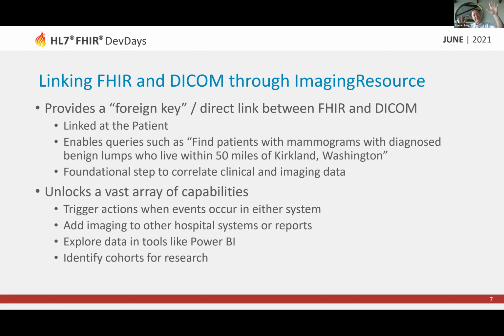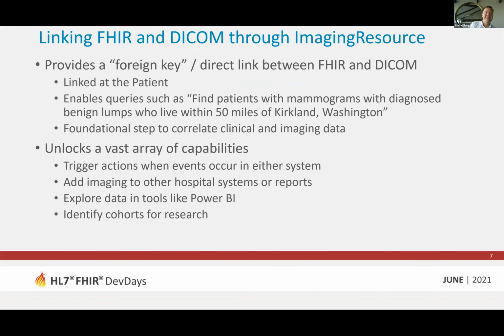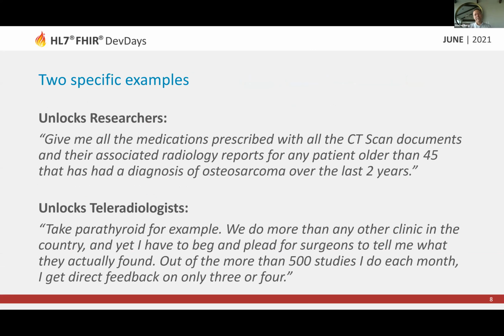But we have all the diagnoses for pneumonia here, but we don't know if there are chest x-rays associated with those. Well, now we know. And that's the important thing for linking those two things together and helping streamline that. Here are two examples. I love both of these.